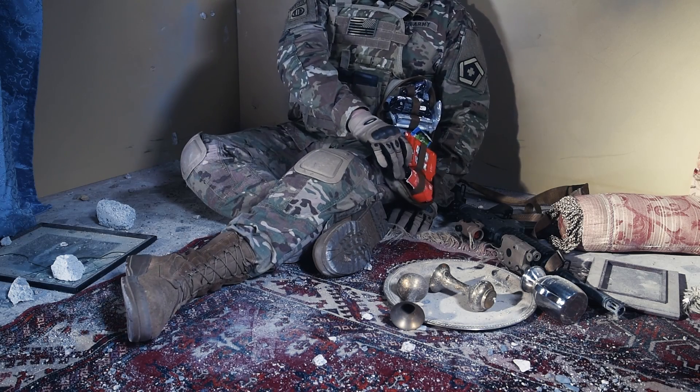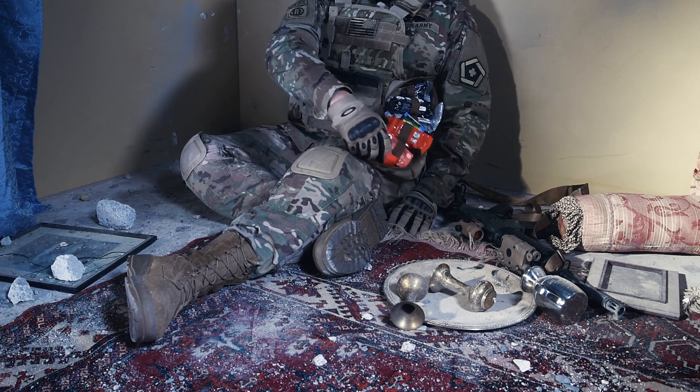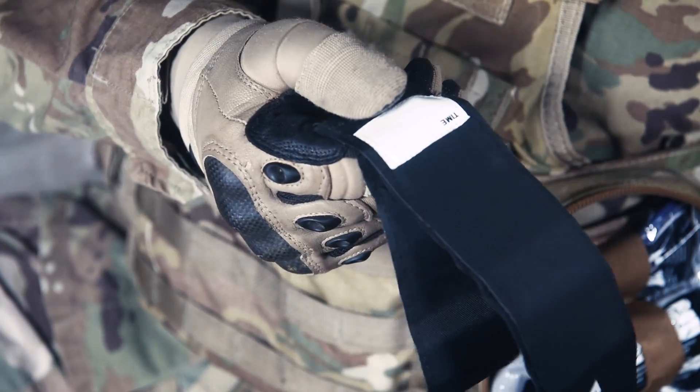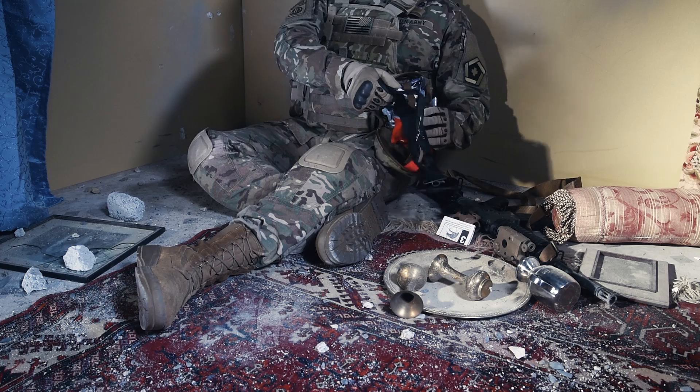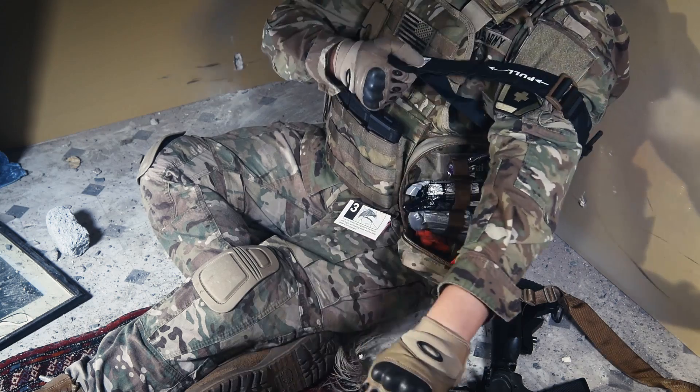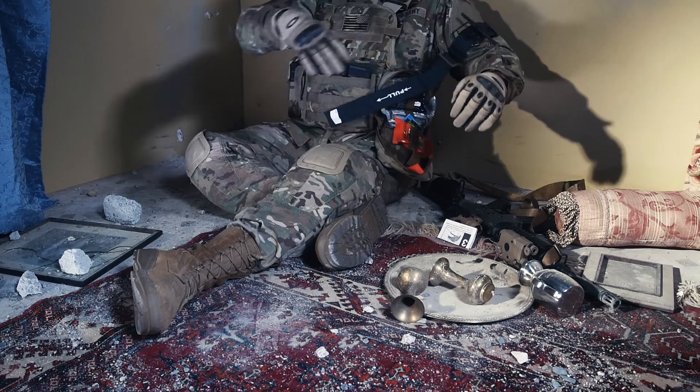Now let's go through the proper steps for TMT self-aid application. Hold the end of the strap by the white time label tab. Allow the TMT to fall open. Place the TMT over the injured extremity, high and tight, above the wound. Separate the Velcro tail from the TMT.